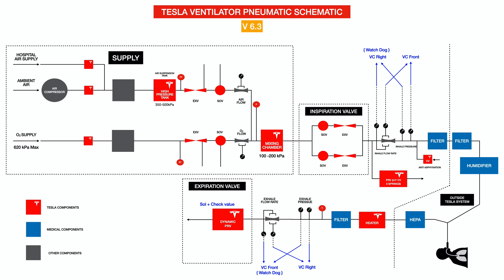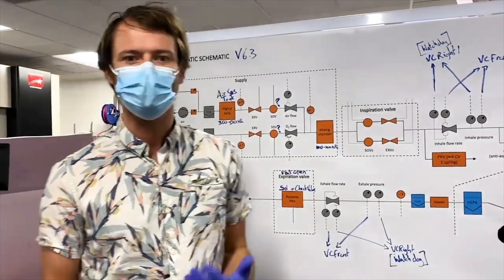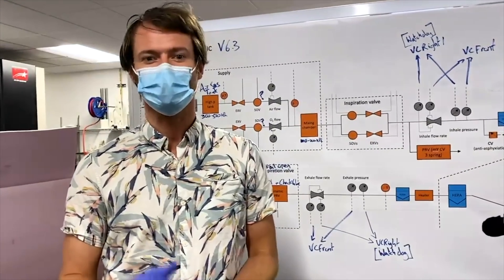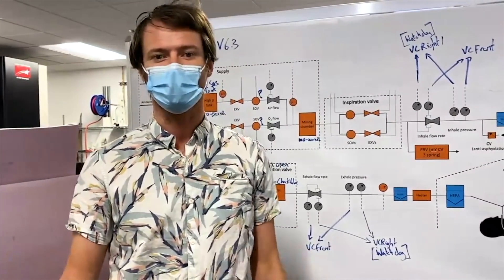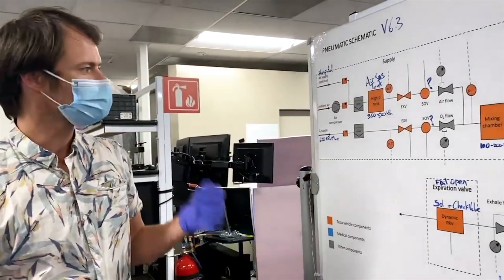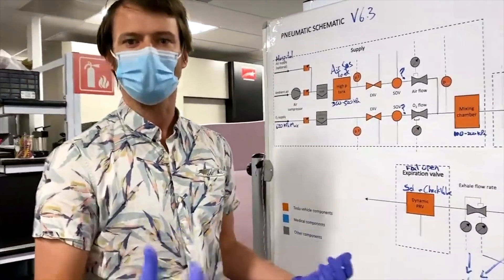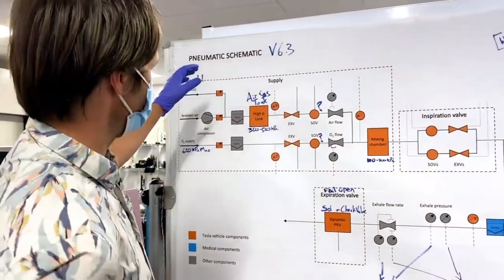Now for more clips from Tesla's own video. We've been working on developing our own ventilator design, specifically one that's heavily based on Tesla car parts. We want to use parts that we know really well, know the reliability of, and can move fast on — and they're available in volume. A ventilator is a device that helps patients breathe who can't breathe well for themselves, by forcing air into their lungs with pressure or volume control and then exhaling passively.